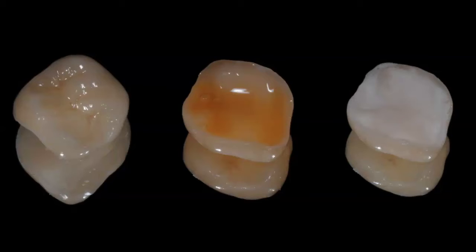You may want to know exactly how much time the lab is allowing the hydrofluoric acid to stay on the intaglio surface of the restoration. As we know, if we're using lithium disilicate, we want that to be no more than 20 seconds. If for whatever reason the lab is either under-etching or, the majority of times, over-etching the intaglio surface, this is going to affect the bond strength between the restoration and the tooth structure. For that specific reason, I like to have this under my control, so I ask my lab not to etch my lithium disilicate restorations, and that's what you're seeing here.